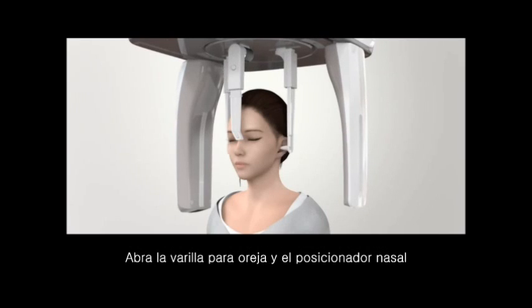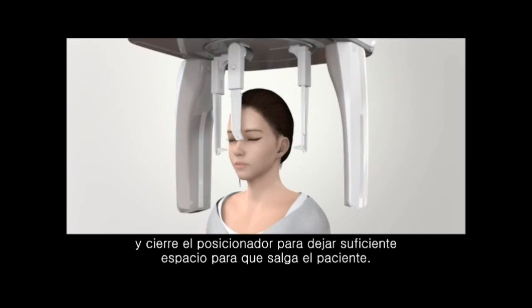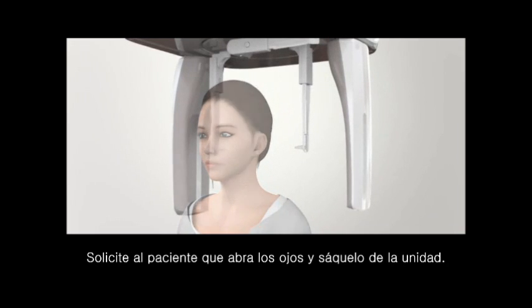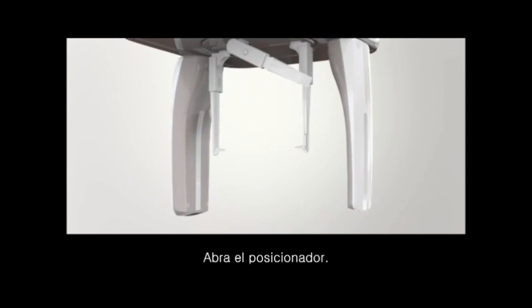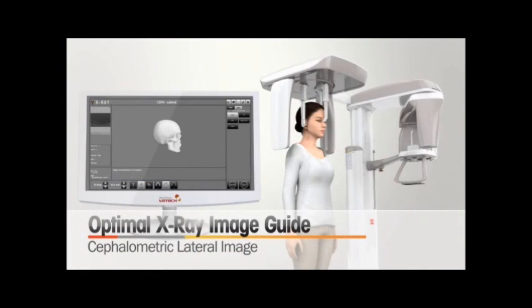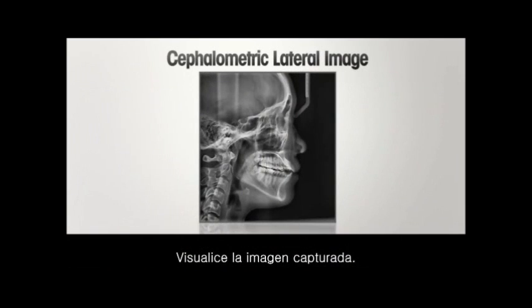Open the ear rod and the nasal positioner and fold the positioner to make enough space for patient going out. Ask the patient to open the eyes and guide patient out from the unit. And unfold the positioner down. Check the captured image.